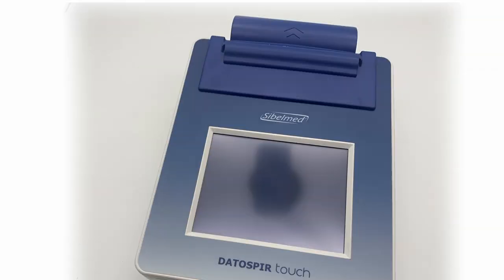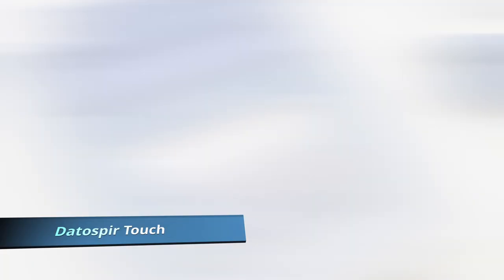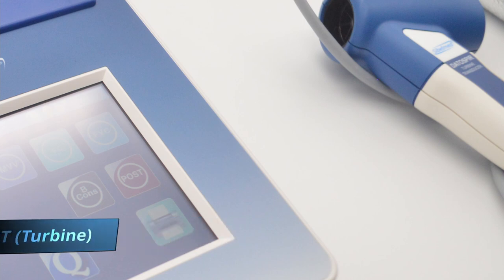Welcome to the Datospir Touch training video. This video will guide you on the first steps with your Datospir Touch Spirometer.